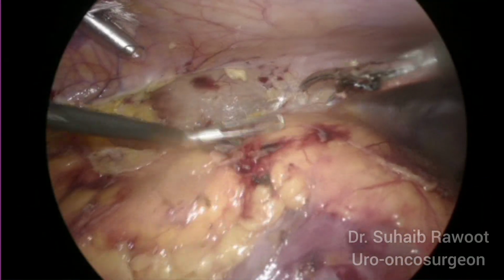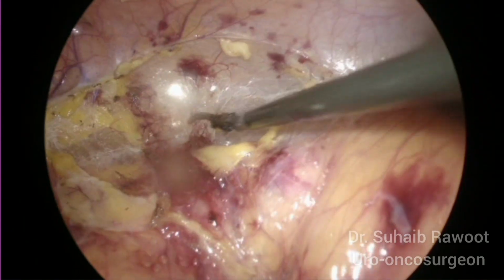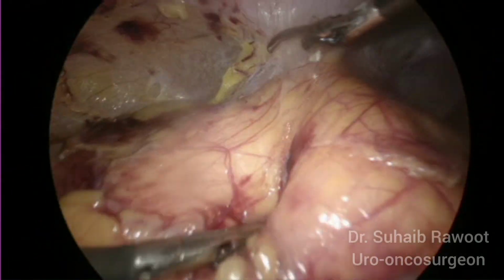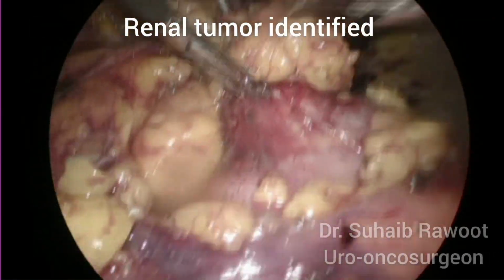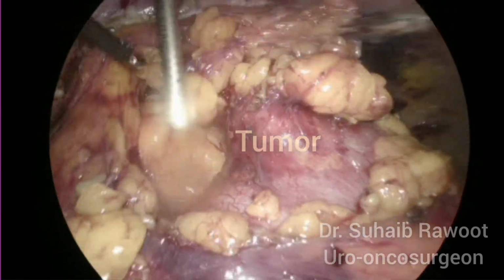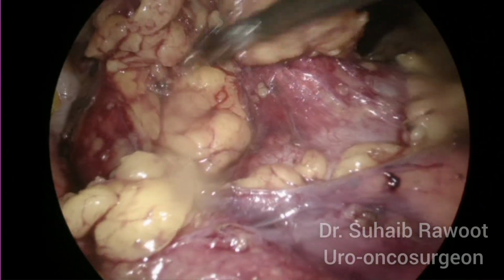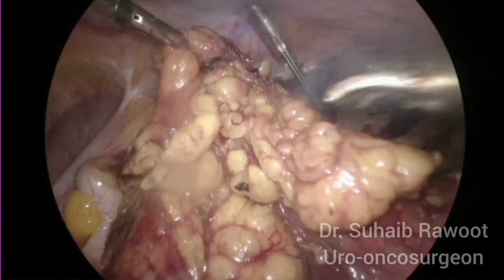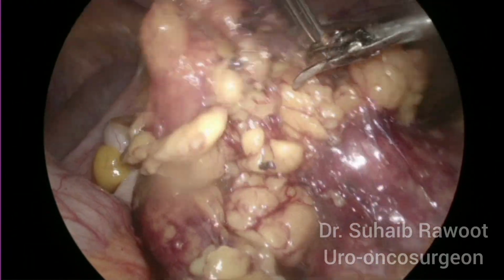The tumor is now visible, but we are not able to get all around the tumor. So we need to flip the kidney a little bit more. We have flipped the kidney completely. Tumor is also visible. Now we need to dissect the fat around the tumor circumferentially so that the tumor stands alone and the suturing becomes easier.